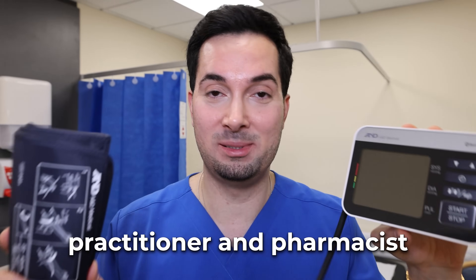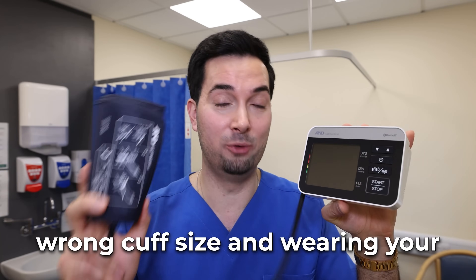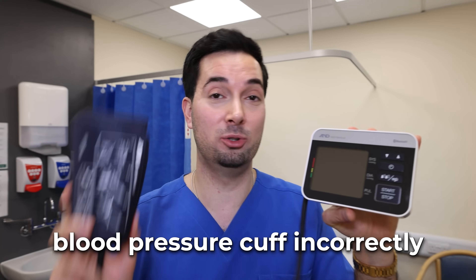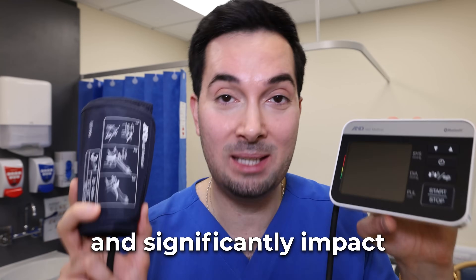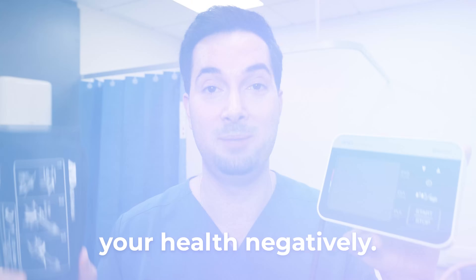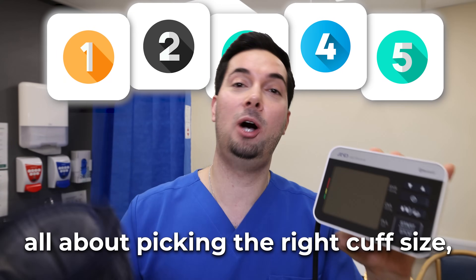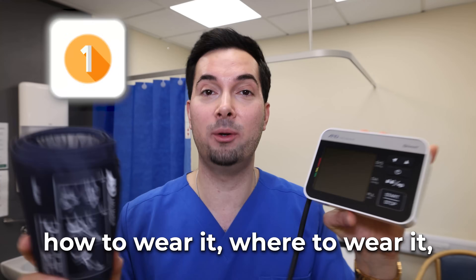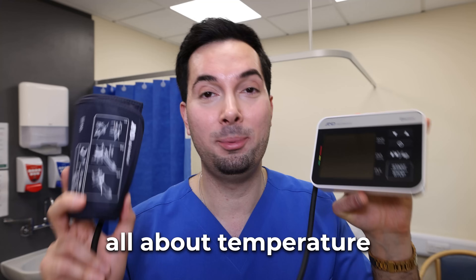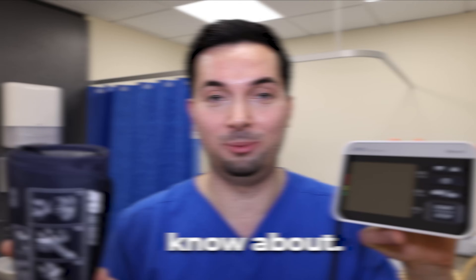As an advanced medical practitioner and pharmacist practicing in family medicine, I definitely know how wearing the wrong cuff size and wearing your blood pressure cuff incorrectly can give inaccurate blood pressure readings and significantly impact your health negatively. In this video I'm going to share five top tips about picking the right cuff size, measuring your arm, how to wear it, where to wear it, and a bonus tip about temperature and how it affects blood pressure — something not a lot of people know about.